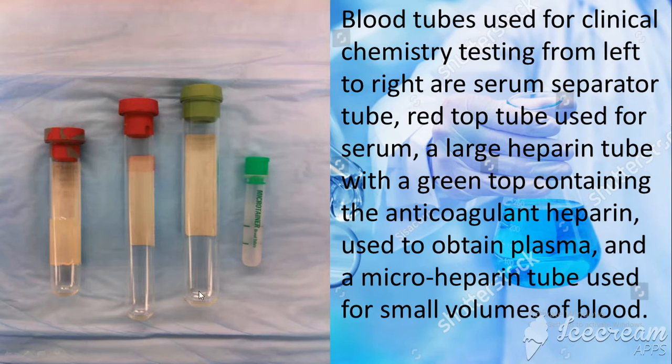So here, if we want to get the plasma, we use this type of tube because it contains anticoagulant materials, for example, heparin or EDTA.